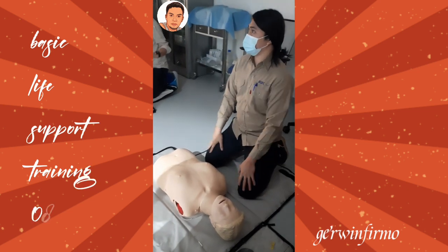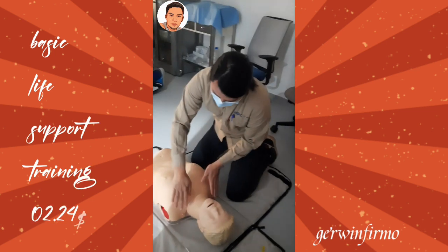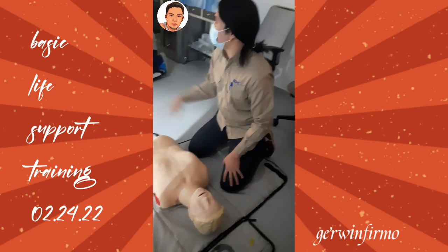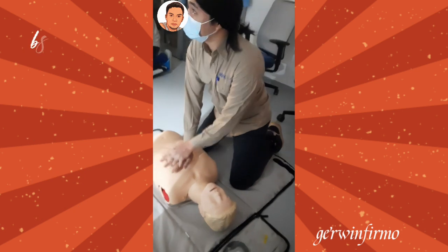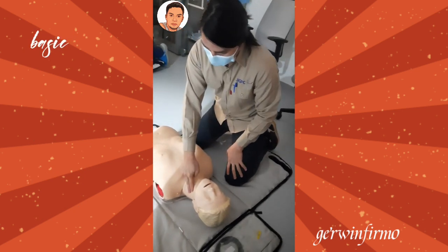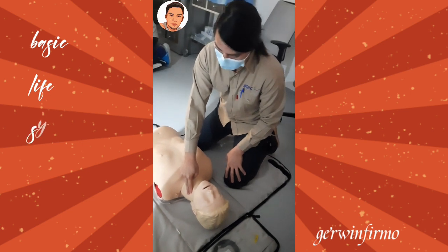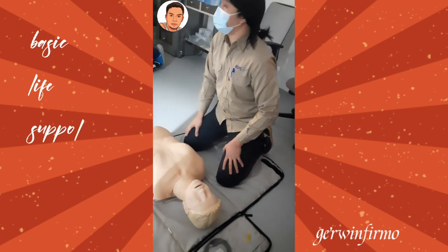Hey, are you okay? Help! Someone help! Check pulse and breathing. 1 and 2 and 3 and 4. Activate the emergency response and get an AED. Get an AED.